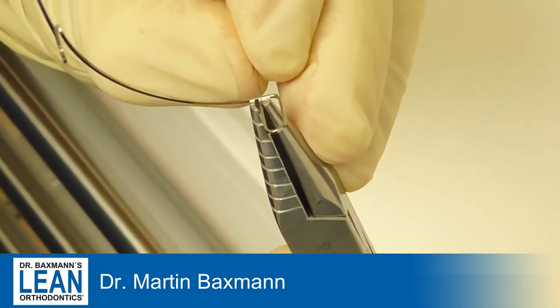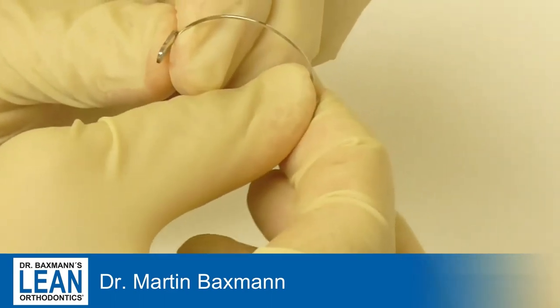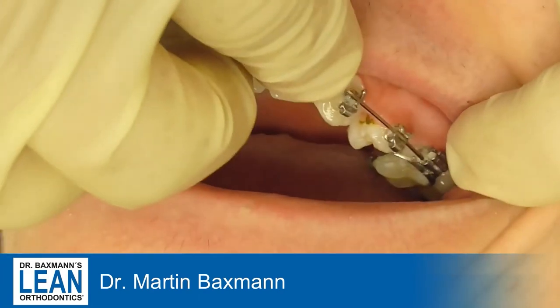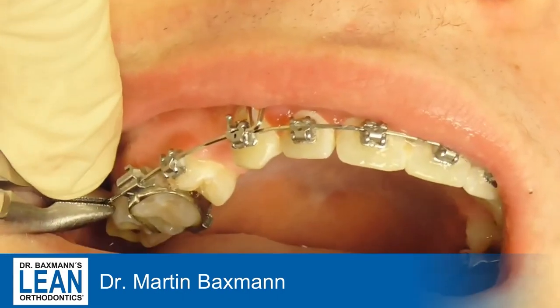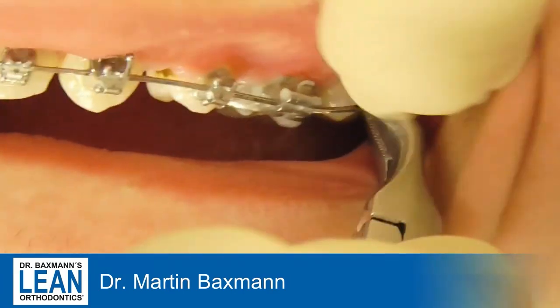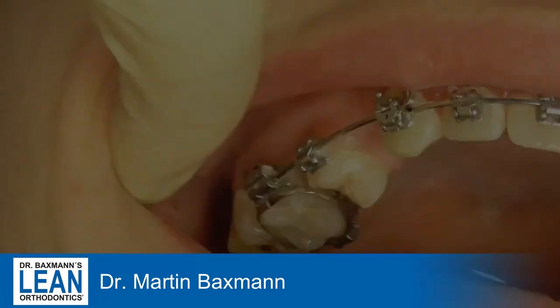That's how you do it — easily and quickly done. You need to adjust the width of the wire as well, because when you take something off the sagittal plane the wire will get wider, so you need to bring that arch form back. Place it into the molar tubes first, then attach it in the front. You can see when you pull it to the back the wire is activated. Make a sharp bend at the end and cut it short. Same on the other side — pull it back, make a sharp bend, cut it off. Now you have a nicely activated loop wire.